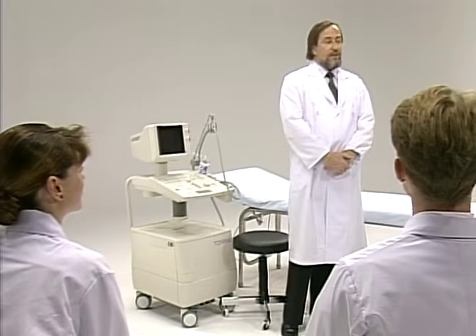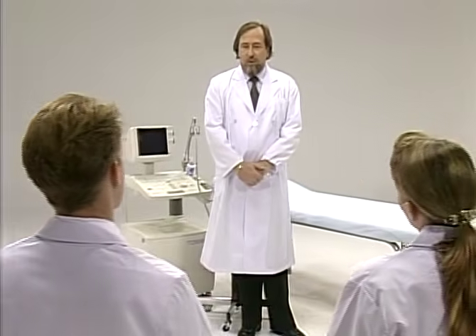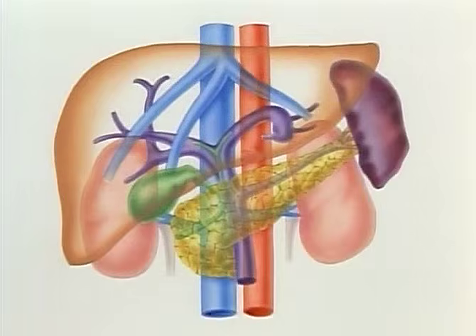Ultrasonography is characterized by the real-time imaging of planes within living soft tissue, which could not be visualized previously. Ultrasonography is painless, non-invasive, and cost-effective. Thanks to these advantages, ultrasonography has become the preferred modality for a wide range of abdominal screening examinations. It is especially effective in evaluations of the liver, gallbladder, pancreas, kidneys, and spleen. Recently, the digestive tract, such as the stomach and the intestines, has also been successfully visualized.